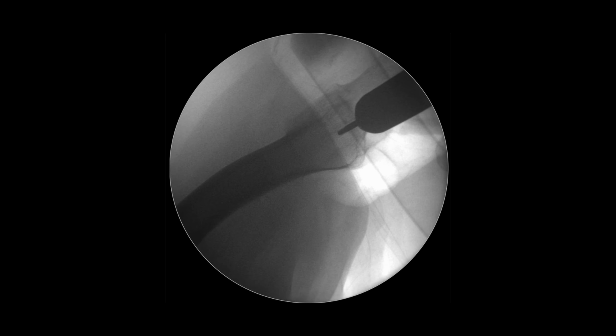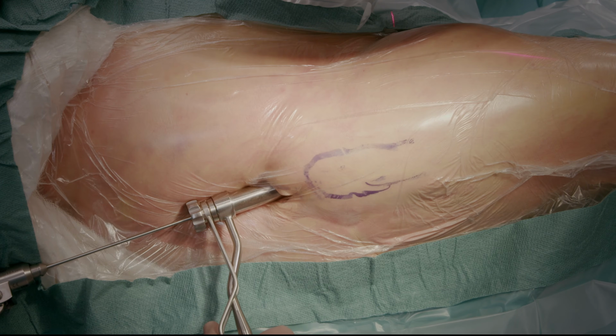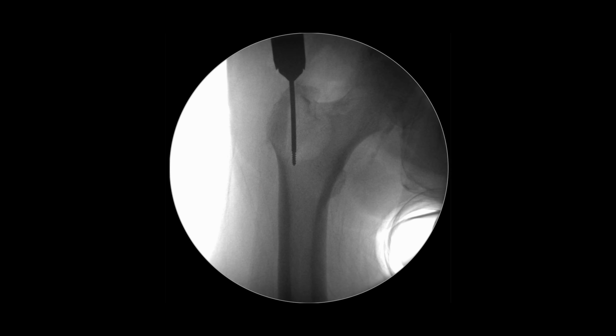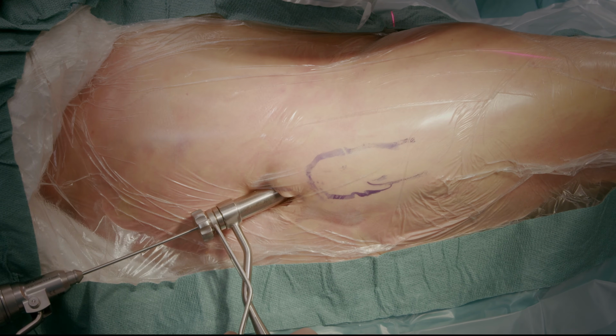Now we have the so-called true lateral view. With this view, it's easy to ascertain that the wire is at the correct location. If we visualize that the pin continues straight forward, we can see that it's directed right towards the femoral diaphysis. Now that we've confirmed that the guide wire insertion site is appropriate, we drill the guide wire further in. We can direct it even slightly more medially.